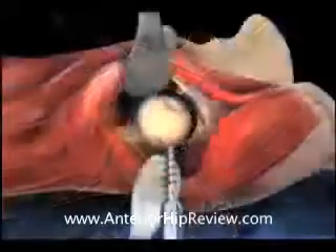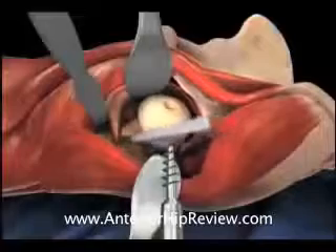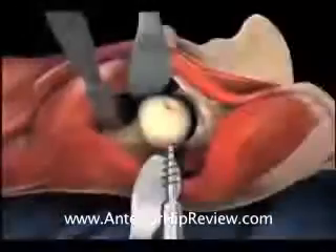Once the head and neck have been appropriately exposed, the capsular release is completed and an oscillating saw is brought into the surgical field in order to remove the diseased and arthritic femoral head.